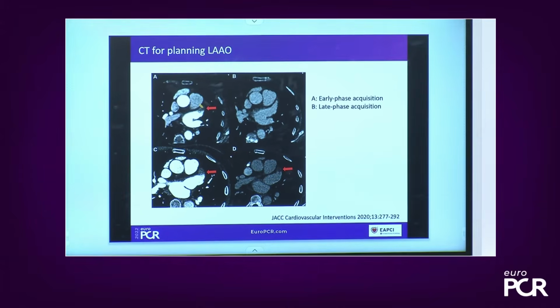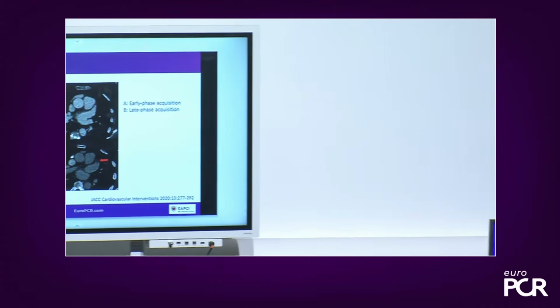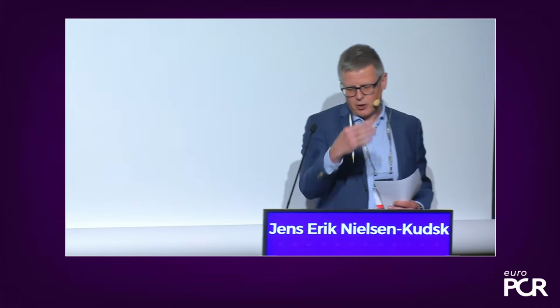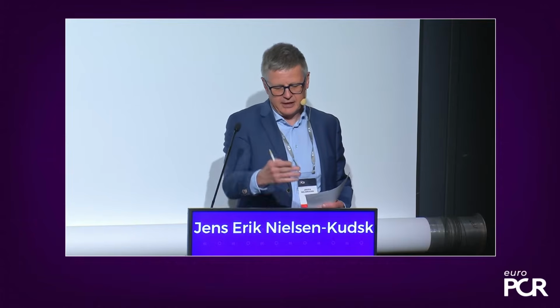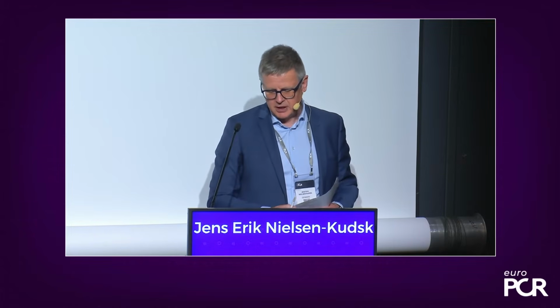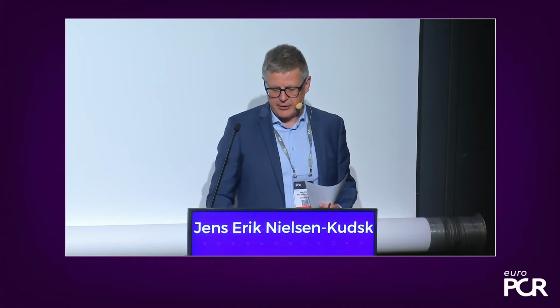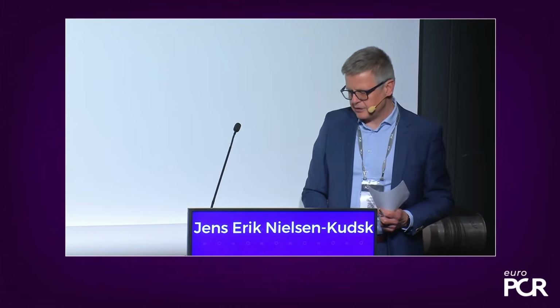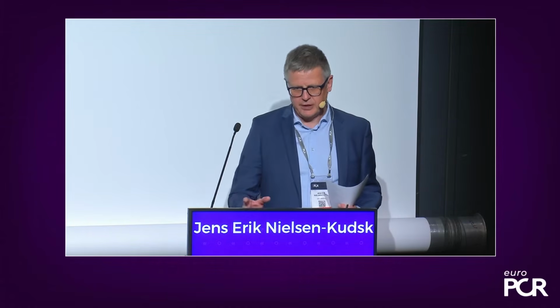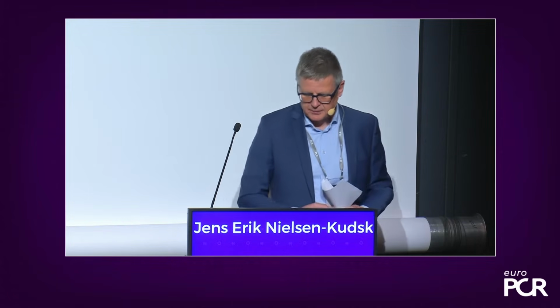measurement. And you can see where you had the two rings before, the landing zone and the orifice. You can be sure with CT that you are absolutely perpendicular to the landing zone and at the right level of the ostium. And you can measure out the minimum, the maximum diameter, even the area and the perimeter-derived diameters for this appendage. So you can really be very precise in your device sizing with cardiac CT.